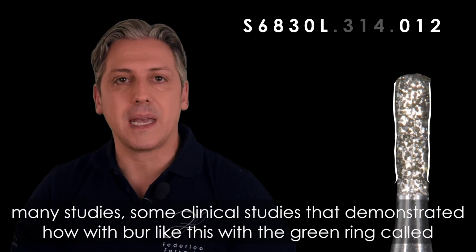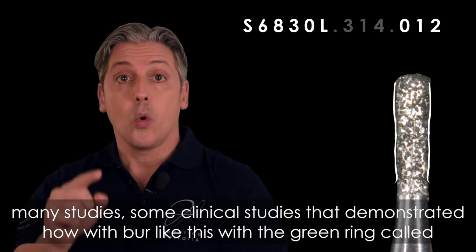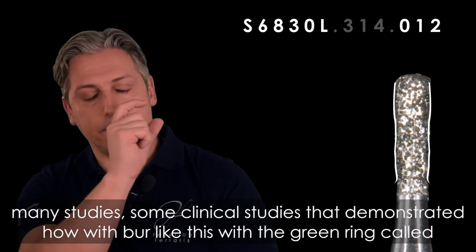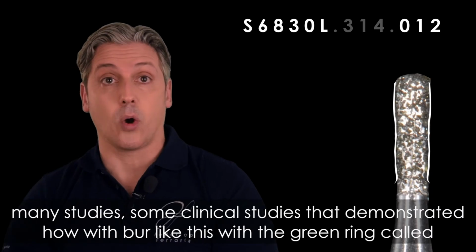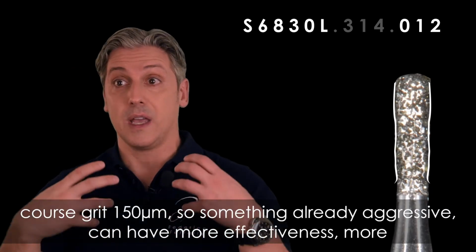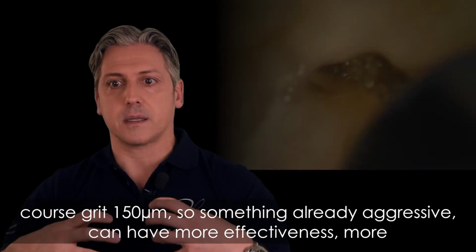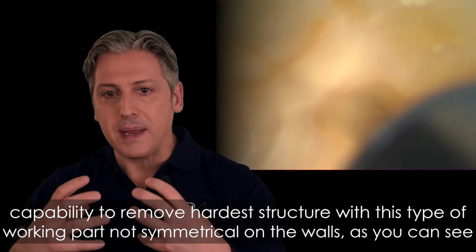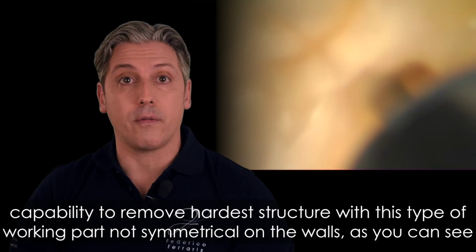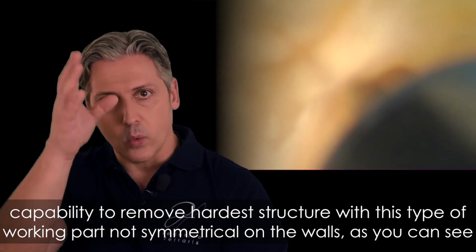There are many studies, some clinical studies, that demonstrated how, with a burr like this, with the green ring code, so coarse grit, 150 microns, so something already aggressive, you can have more effectiveness, more capability to remove hard structure with this type of working part, not symmetric on the walls, okay?